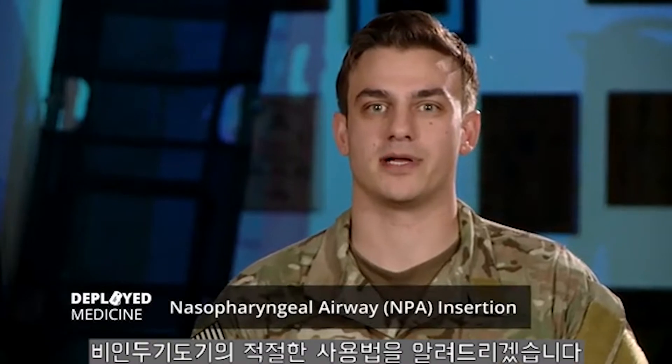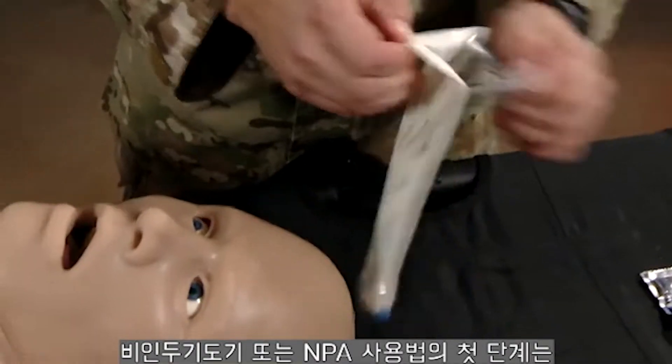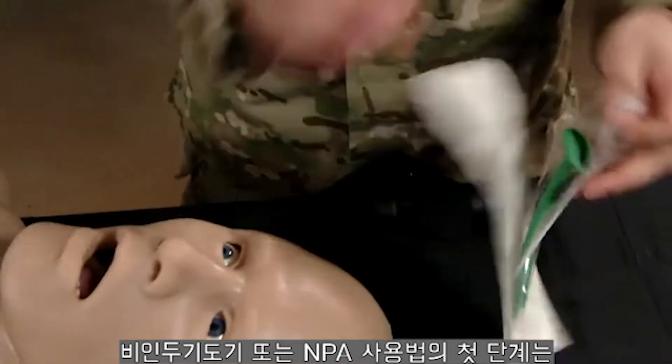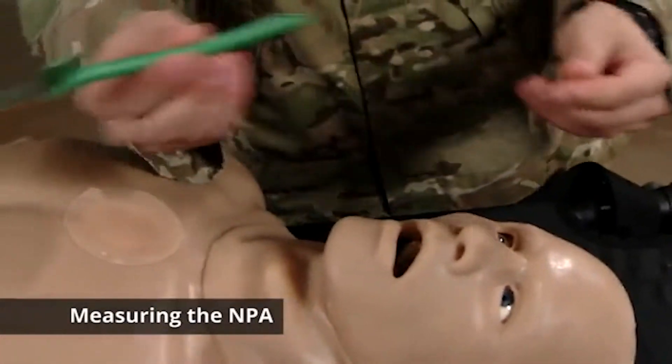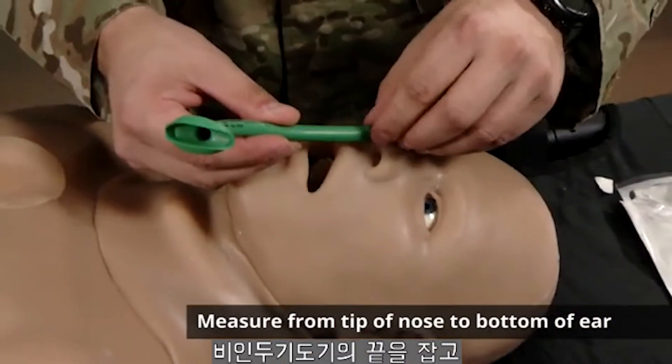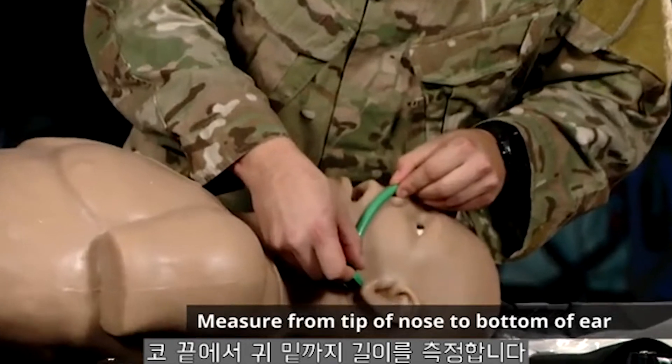Welcome everyone, my name is Stefano and I will be demonstrating proper insertion of a nasopharyngeal airway. The first step in proper insertion of a nasopharyngeal airway, or NPA, is measuring your NPA. You're going to take the tip of the nasopharyngeal airway and measure it from the tip of the nose to the bottom of the ear.